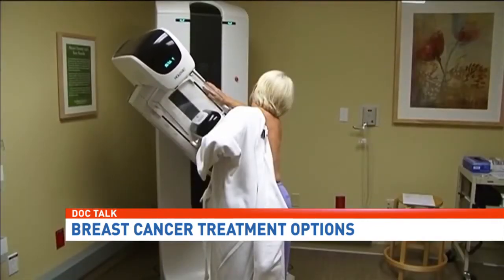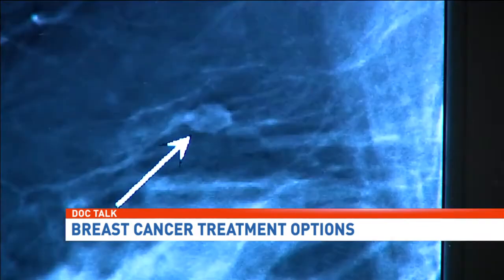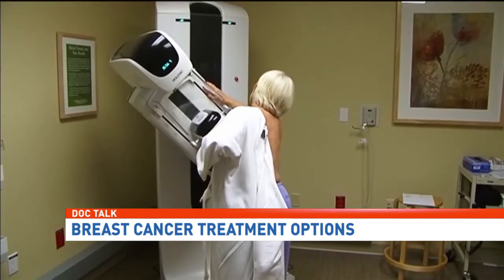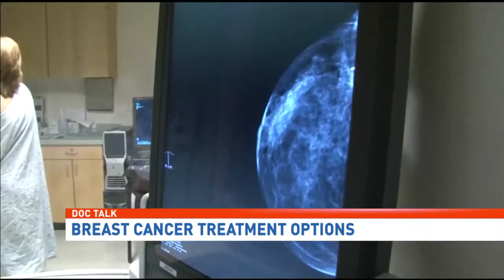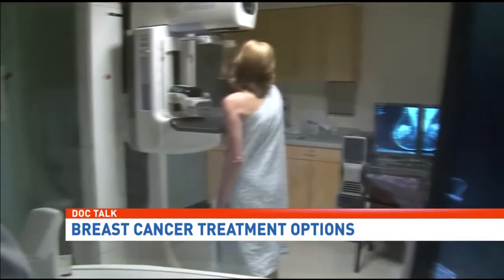Doctors say it's more invasive than regular radiation, but it allows them to target the radiation exactly where it's needed rather than delivering it to the entire breast, which can affect the skin of the breast. The breast does not look as if it has a sunburn. Because after a cancer diagnosis and surgery, who wants any more pain?